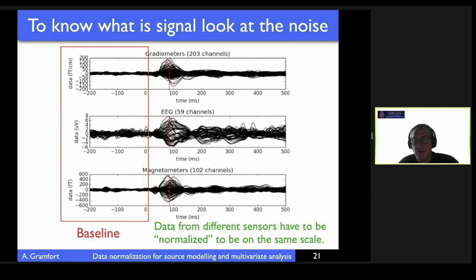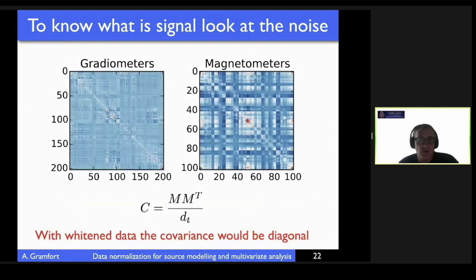So in some sense, you have apples, bananas, and strawberries, three quantities with three units, and you're trying to combine them and normalize or scale them properly. Okay, so how are you going to do this? First, you need to look at what we will call the correlation structure or the covariance structure between all of your data. Here, these covariance matrices are quantifying how much two sensors are varying together.